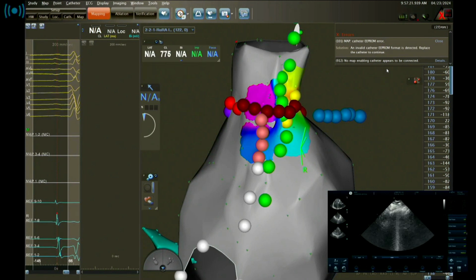All right. So the advice was to change the mapping catheter. Maybe there is something. I will tell you, it's a mapping catheter issue, because the energy is sometimes not under the control. Even if you have switched off the switcher, when you are switching off, there is always some energy going to the catheter. This is a big problem, to the system, not to the catheter, to the system.